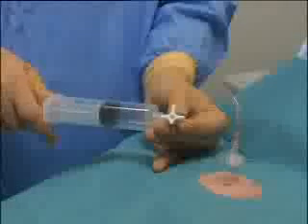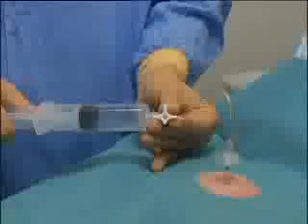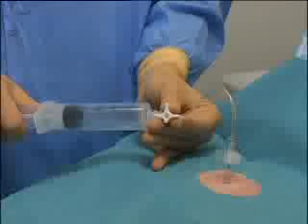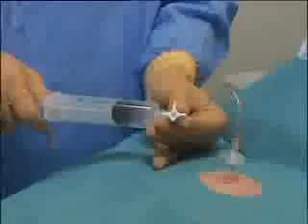Measure the volume of the air that is aspirated by counting the number of syringes evacuated. If more than 2.5 liters have been evacuated, the procedure should probably be stopped because such a large volume suggests that there is an air leak. Continue manual aspiration until you cannot aspirate any more air.